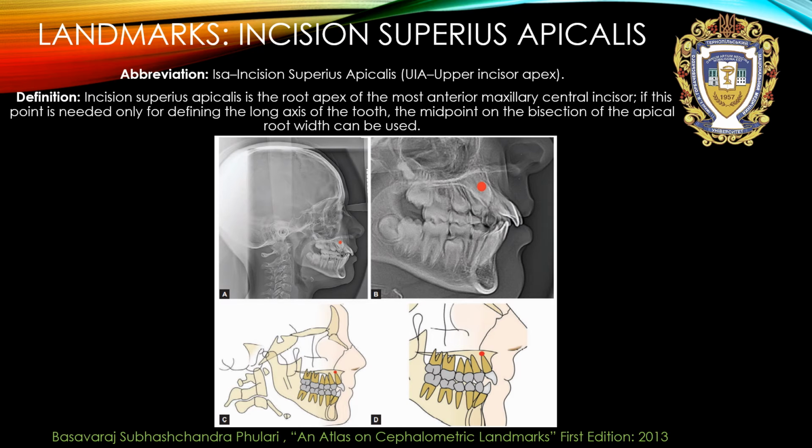Incision superius apicalis, apex of upper central incisor, is the root apex of the most anterior maxillary central incisor. If this point is needed only for defining the long axis of tooth, the midpoint of the bisection of the apical root width can be used.